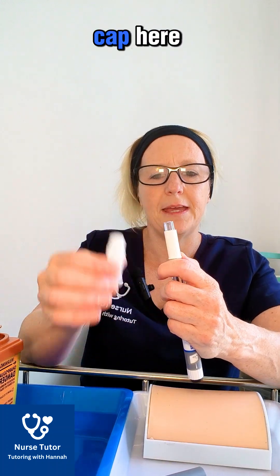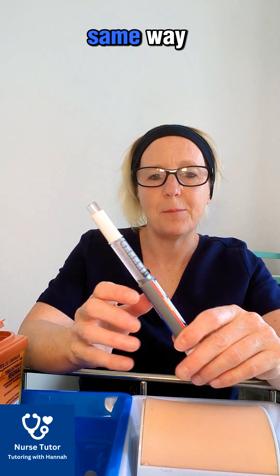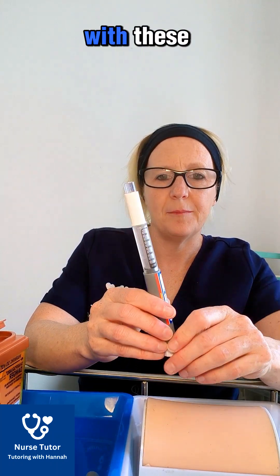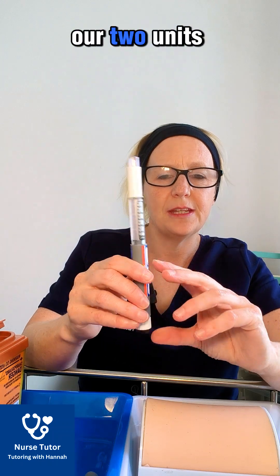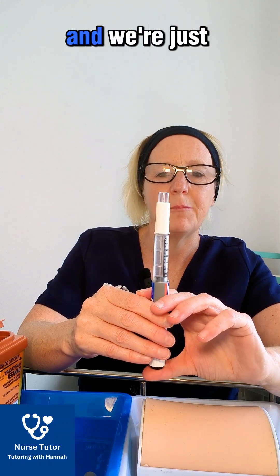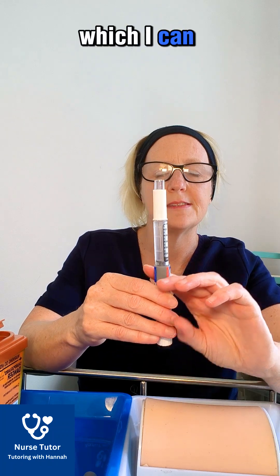Take off the big cap. You need to prime the pen exactly the same way with these safety needles on. We're still going to dial up two units, hold it vertically, and press that button until the insulin comes out at the top.